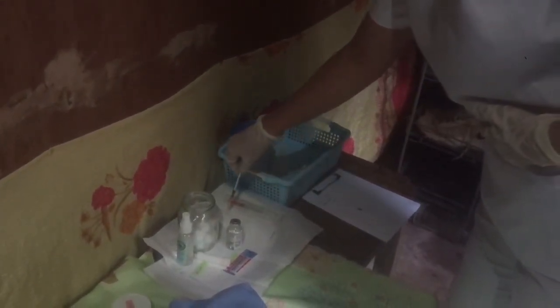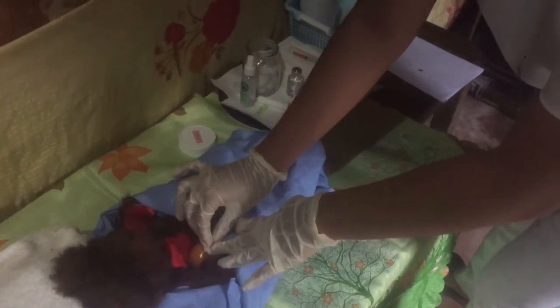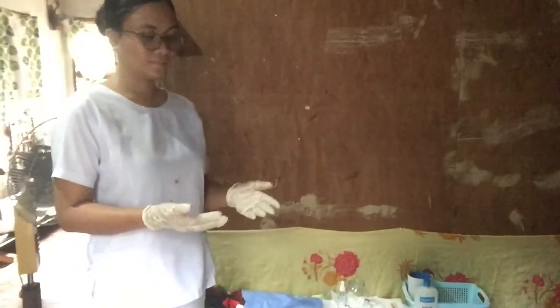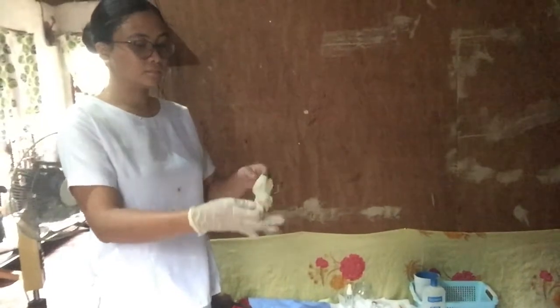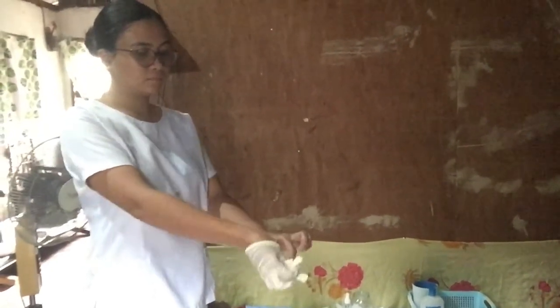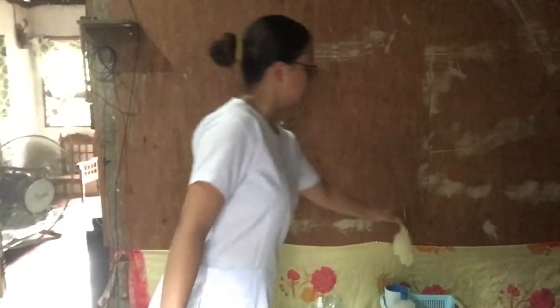After removing the needle, make sure to engage a safety shield or needle guard and discard it in a sharps container. Make sure that you do not massage the area or put a cotton on it. Needle disposal will prevent stick injury. Make sure to discard remaining supplies in order to prevent the spread of microorganisms, and also remove your gloves and perform hand hygiene or use an ABHR.